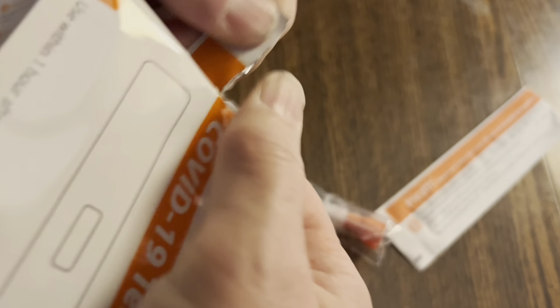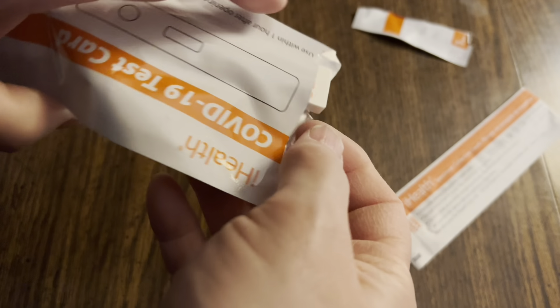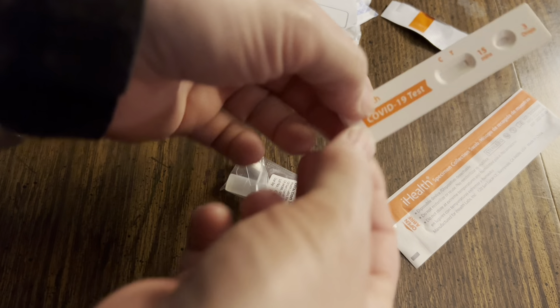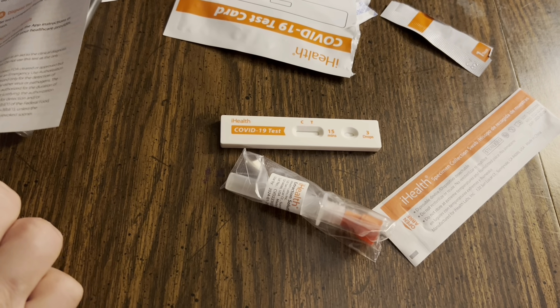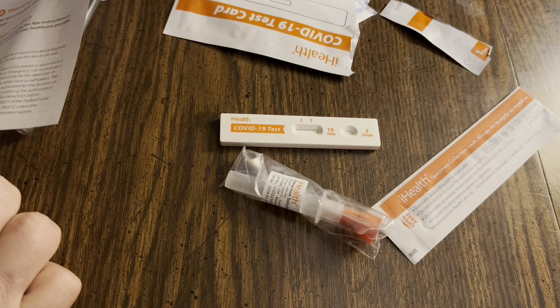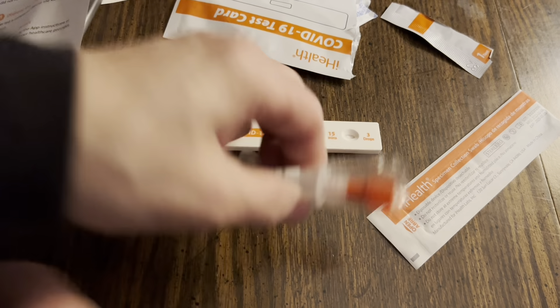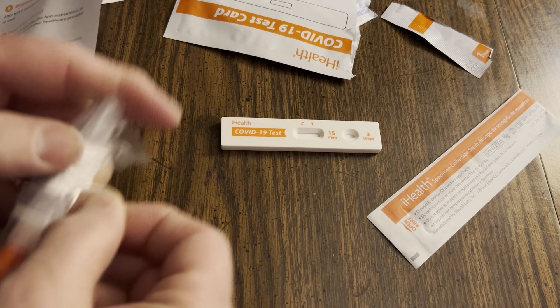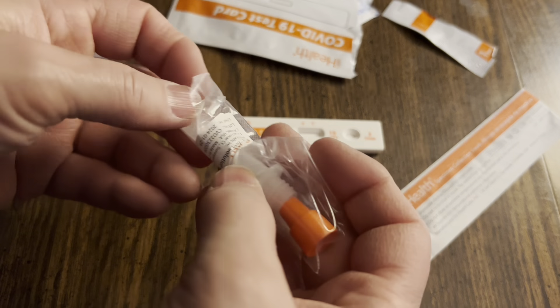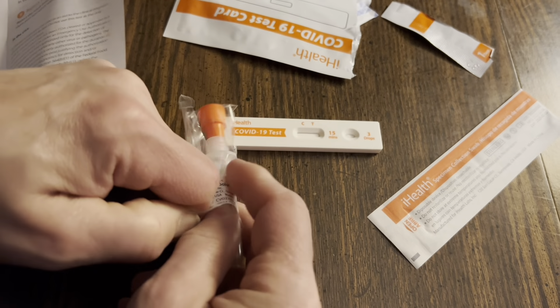Open the package, take out the COVID-19 test card. Right here there's a little notch. You can tear that open, take out the test card — handle it like this so that it won't accidentally contaminate anything. Take out the empty tube.